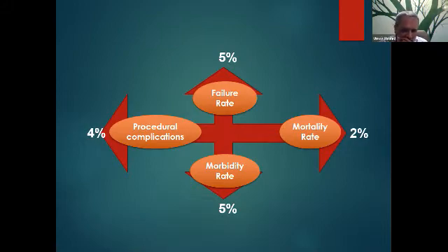The other thing is procedural complications. Generally, we found this complication is more with broad-neck aneurysms. Yes, it could happen. There is migration of small coils. Again, as I've emphasized before, if you properly assess the coil you have to use on 3D, these sorts of complications remain very few. Again, mortality rate: if you select a patient who is already dying, I didn't include those patients.